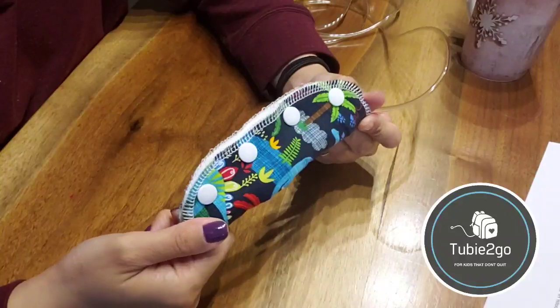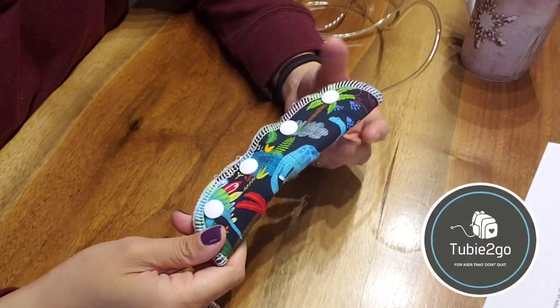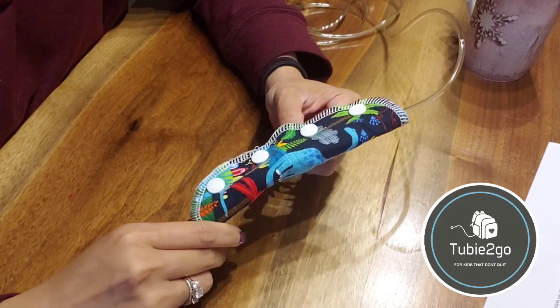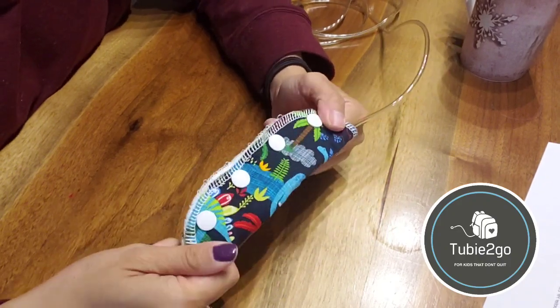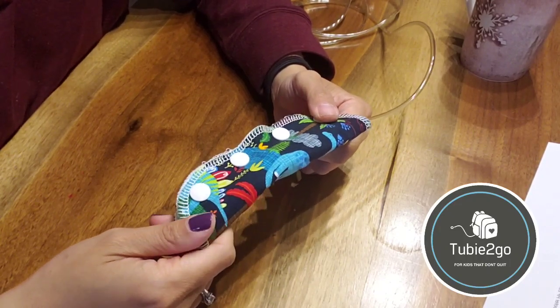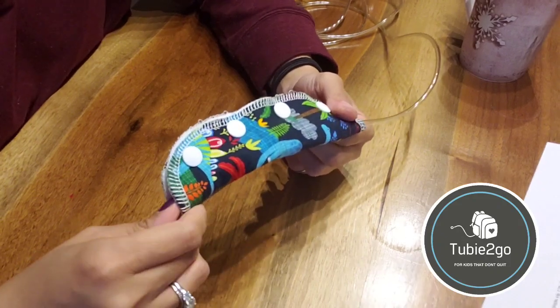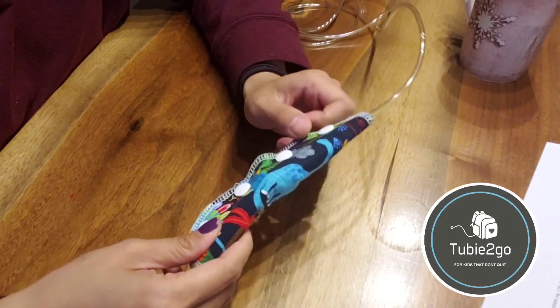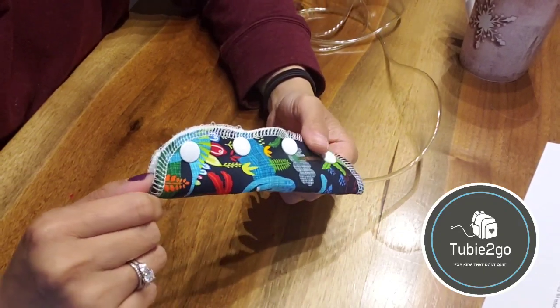So this is a port cover. A port cover is meant to cover your connections to help prevent them from disconnecting, but I imagine it's probably most useful to distract from curious hands that might pull the connections apart, or really if your food is leaking as a result of the ports rubbing up against things that might cause something like the med port to pop open.